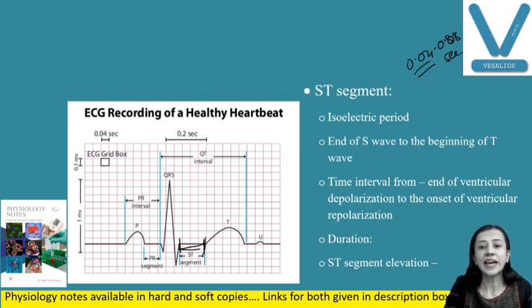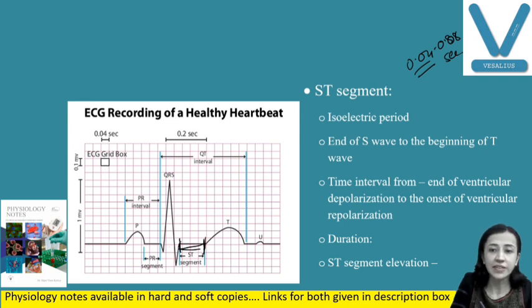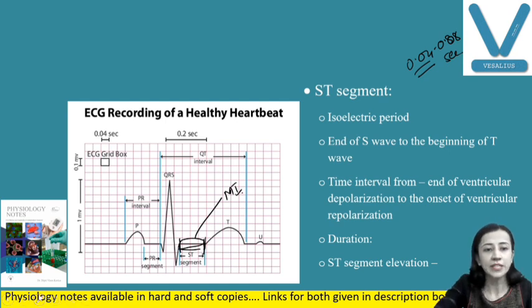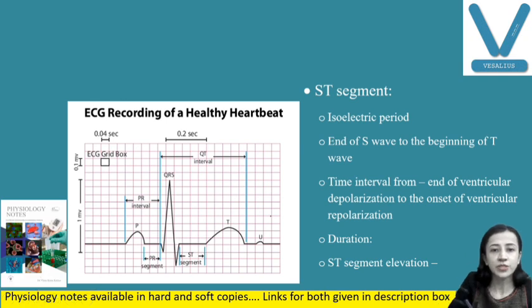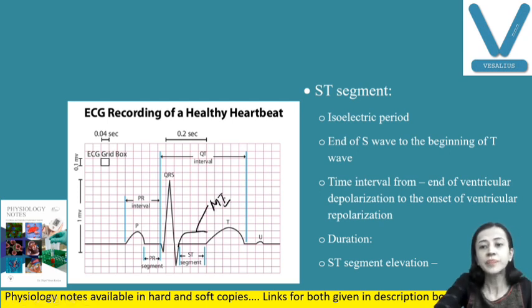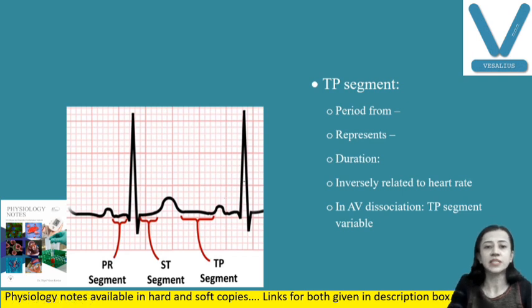Okay, and ST segment, this is elevated in patients with myocardial infarction. Okay, this is the isoelectric line, but if it is elevated, I will show you the elevation. You can see here, this is normal ST, but if it is like this here, this is found in myocardial infarction.